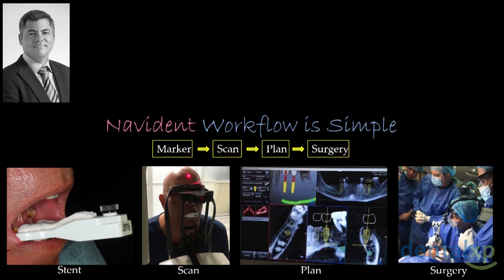The workflow, again, is simple, and remember, in dentistry, everything is about understanding workflow. We have to design a marker and custom fit the marker. Then we bring the patient into scanning. We plan what we are going to do, and we can plan the position of the implants, angulation, size, width, shape. We can trace our nerve. We can create virtual crowns. So many things that we can do. The software is super easy, and we can go into the surgical aspect.